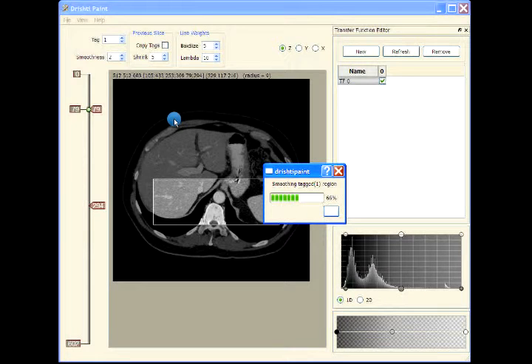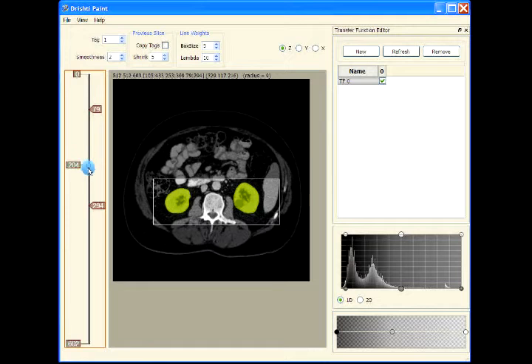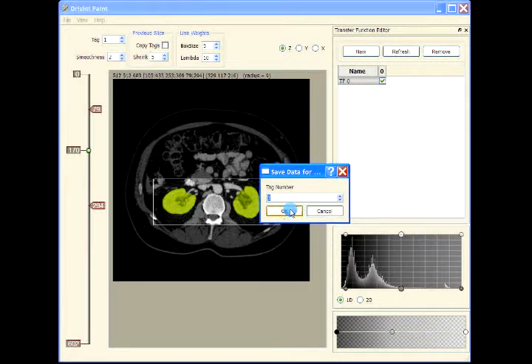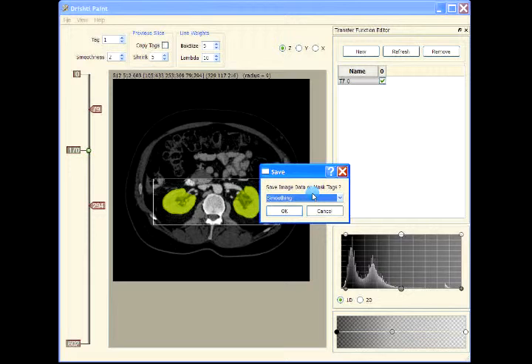Now we'll extract the tags — we'll extract the tag region from the original data, which is the pivot.nc file. This is tag number one. We could also have applied smoothing to the tags here and then extracted the data, but when we apply smoothing while saving, that smoothing is not saved in the mask file.